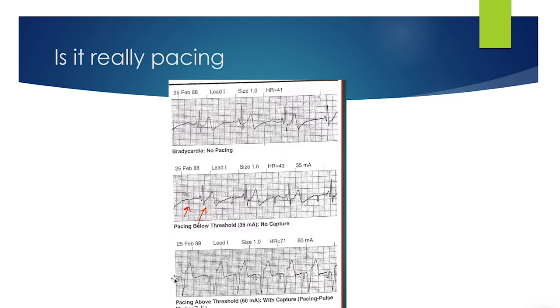And this is an example of true capturing. You see it's before the QRS, and the rhythm now almost looks like a STEMI. You're going to have this wide QRS complex, a broad and wide T wave, and we can say there is possibly ST elevation there. So this is now considered capturing.